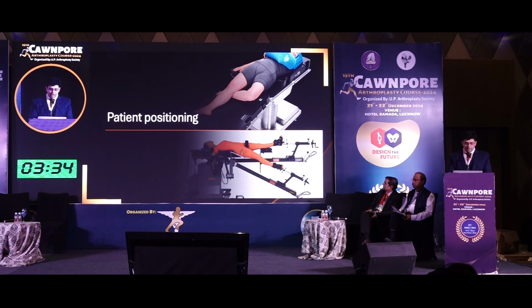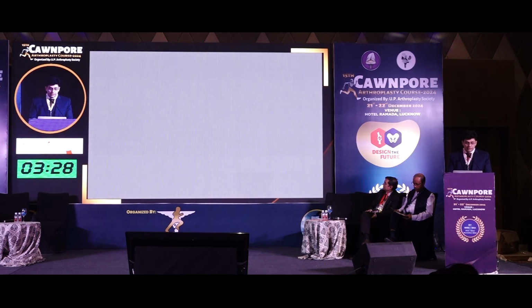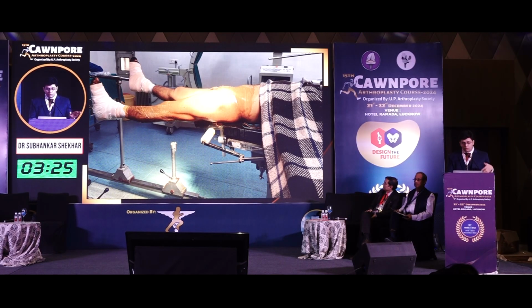Same goes with the fracture table, but you have to ensure that the femur hangs by the side and that you have something to elevate the femur. This is my iteration of it. I've gone through all the tables. I find this very easy.